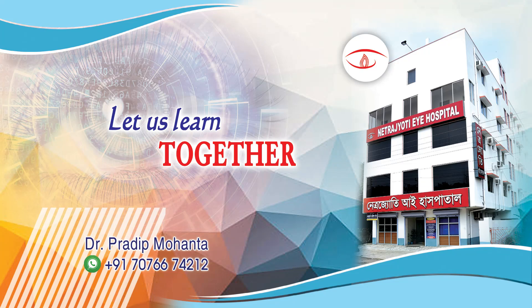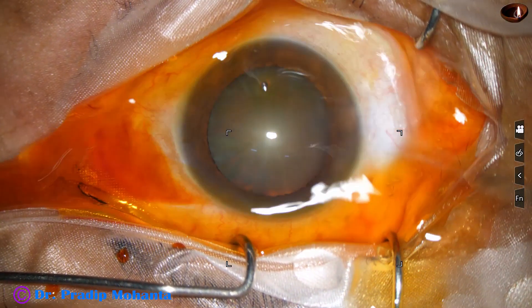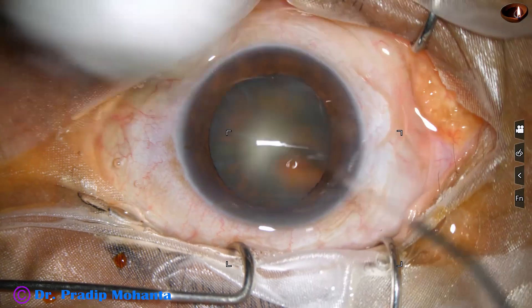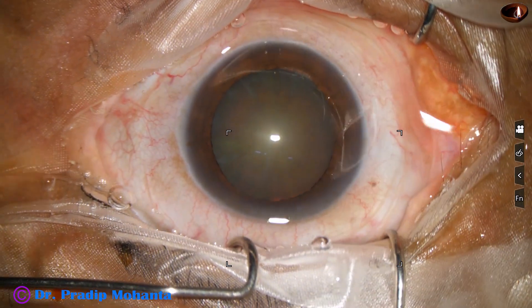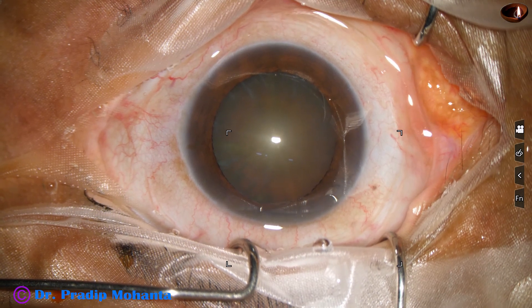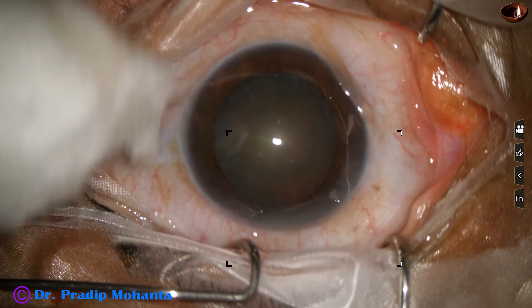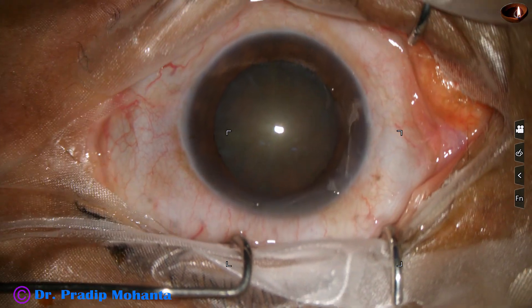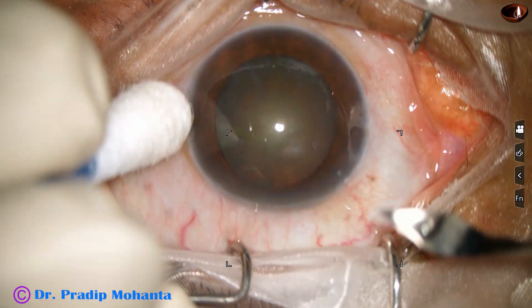Friends, let us observe this totally unedited surgery. This is a cataract with grade 3 nucleus sclerosis. The ocular surface is thoroughly irrigated with BSS, applying few drops of povidone iodine. And then the main wound is created.